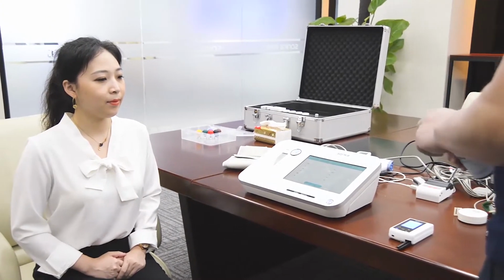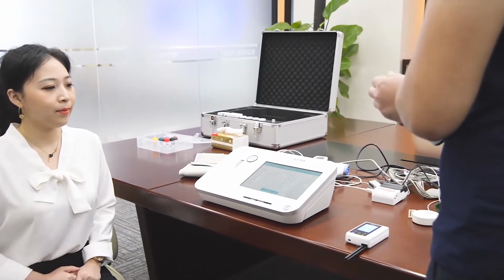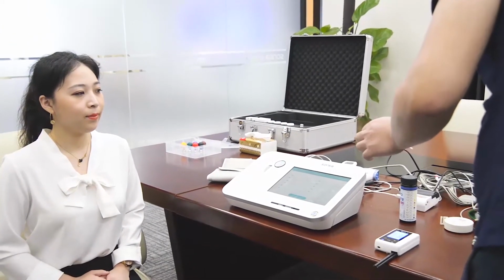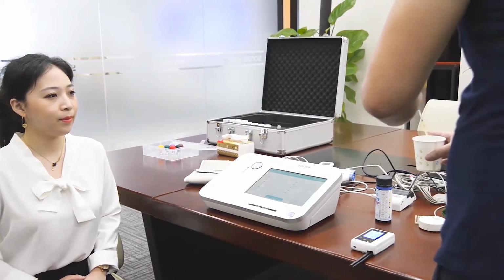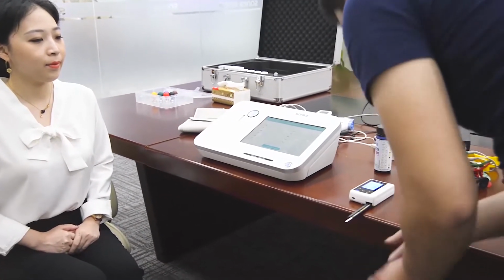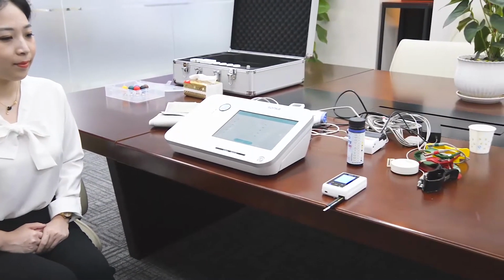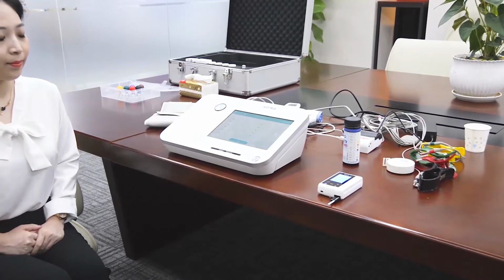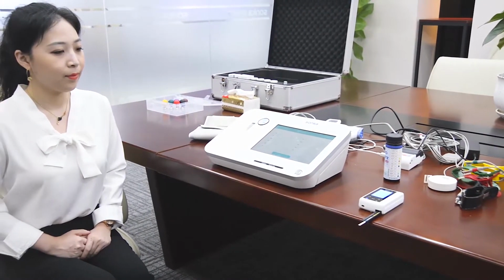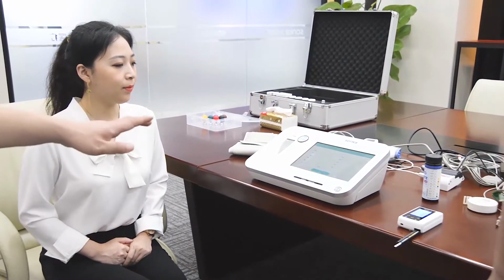We have a test paper here. After the patient takes the urine sample, we just put the test paper into the cup. You can see the paper here, and press the test button. Okay, the result can be transferred to the machine.